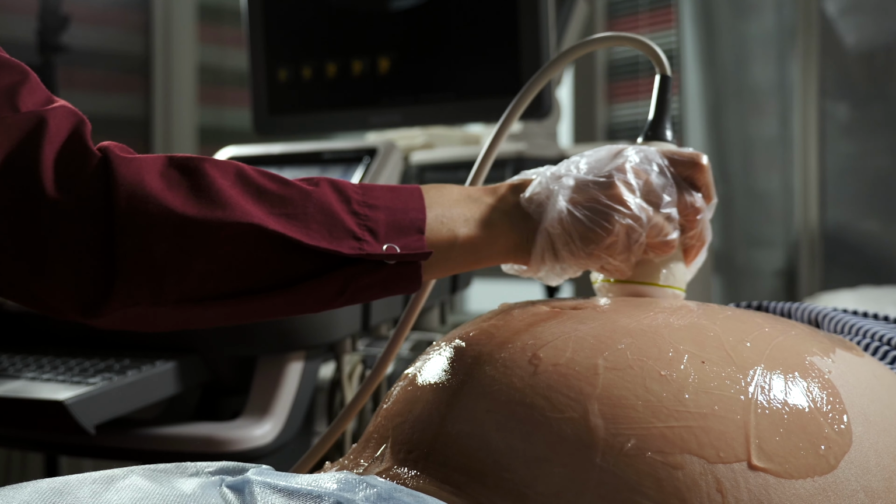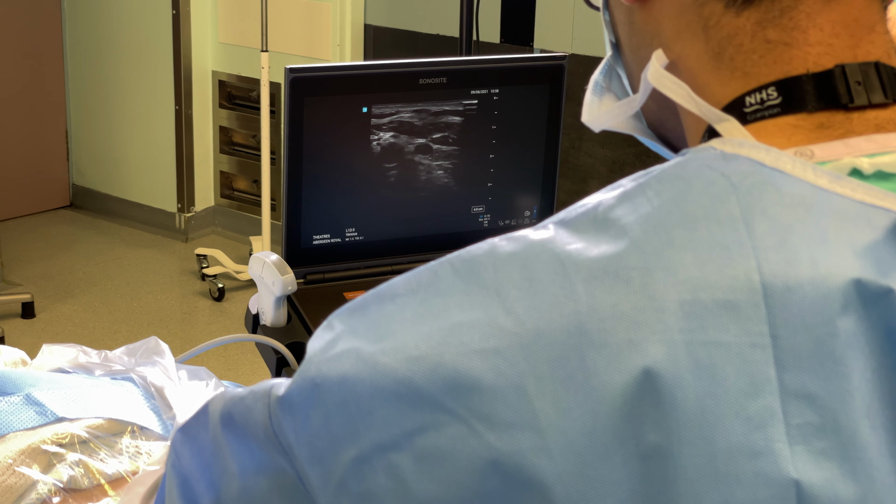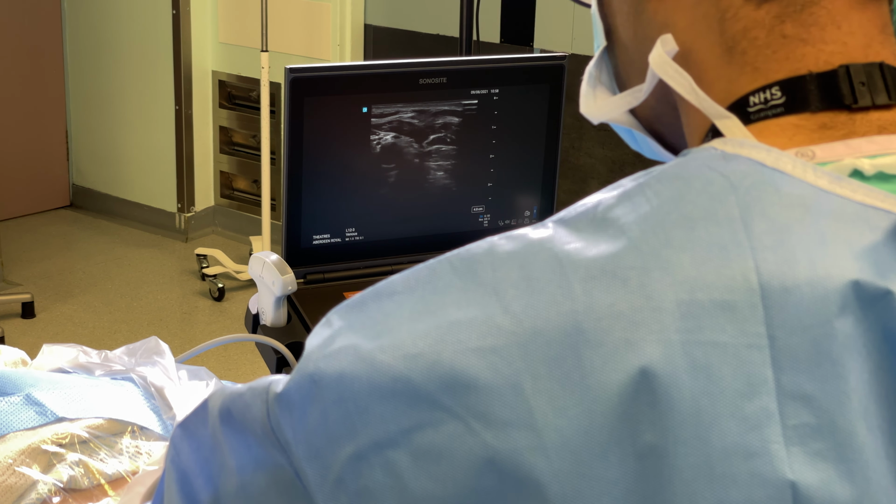So why? It's portable. Machines are getting smaller and smaller. It's pretty easy to learn and it's moderately priced. It's got zero radiation risk and it provides real-time guidance during invasive procedures. For balance, however, although it is a simple imaging tool, the associated skills of needle handling and probe positioning will require time and experience to develop. You will benefit from one-to-one supervision until your experience builds.